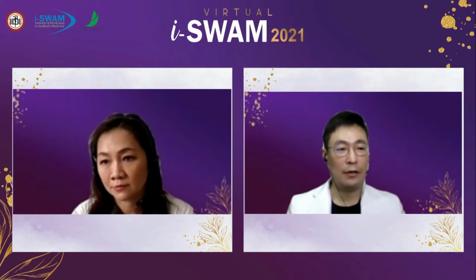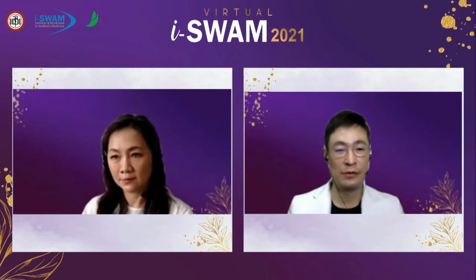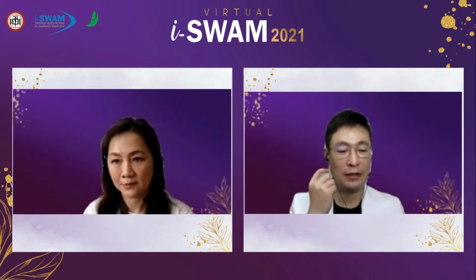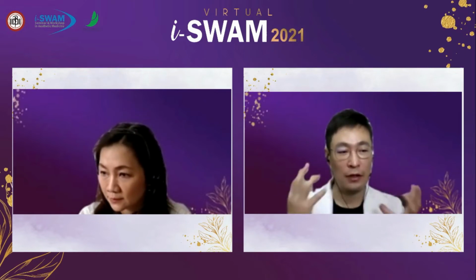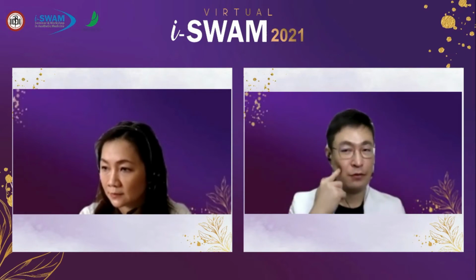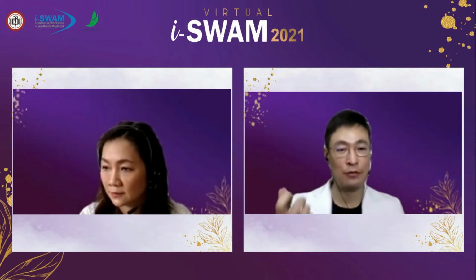Usually, there's no need to fix all small dimples on the treated area. But if there is a strong dimple, I mean, if you can see it without moving the expression muscles, if you see a prominent dimple, then it's better to release it before finishing the treatment.